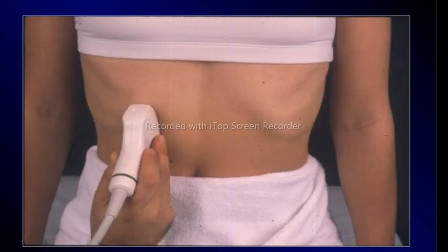Again, your patient can be seated upright, and in this erect position, you can image your gallbladder, and this is the position where you expect to see the gallbladder. But just like I mentioned, there could be small alterations. You might find the gallbladder is not in this spot, but somewhere here, and you'd have to slide your probe to this side or to this side. If it's oriented like that, then your probe should lie along that orientation.